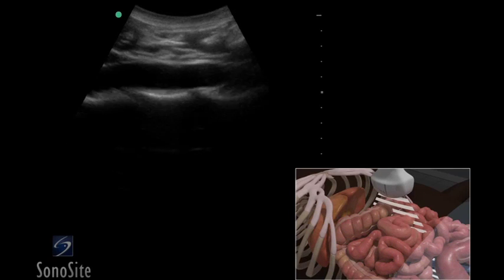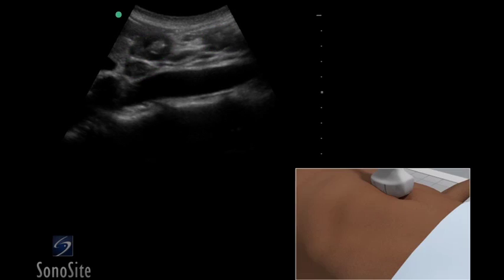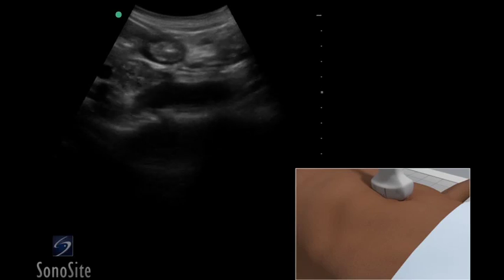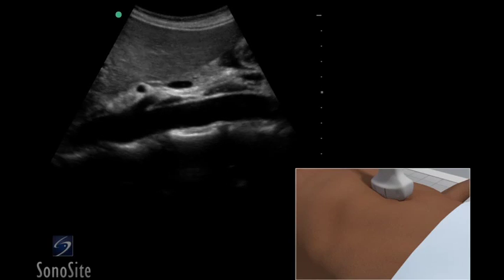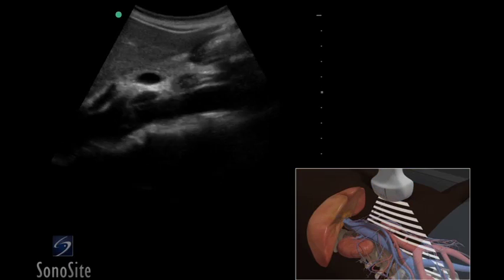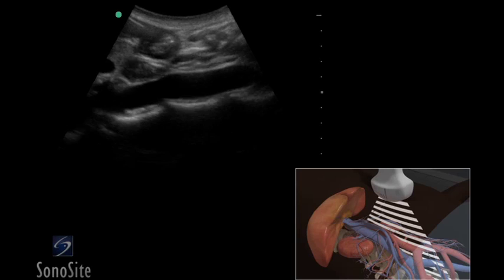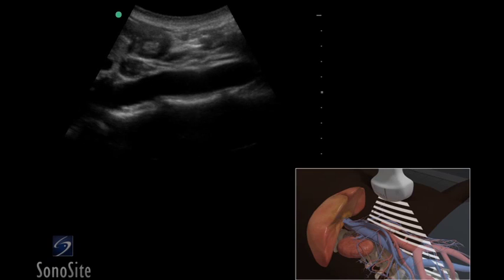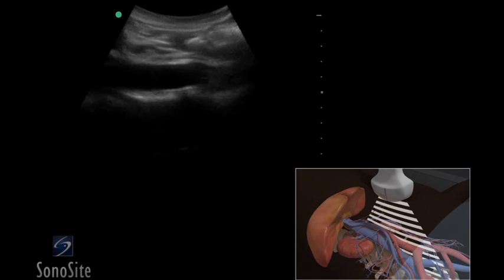If the aorta is difficult to visualize due to overlying bowel, gentle downward transducer pressure may encourage peristalsis of the overlying bowel. Alternatively, consider moving the patient into a left lateral decubitus position to reposition the bowel away from the field of view.